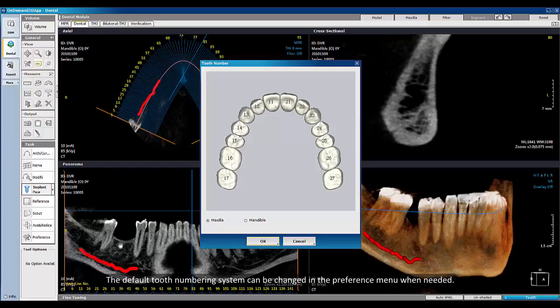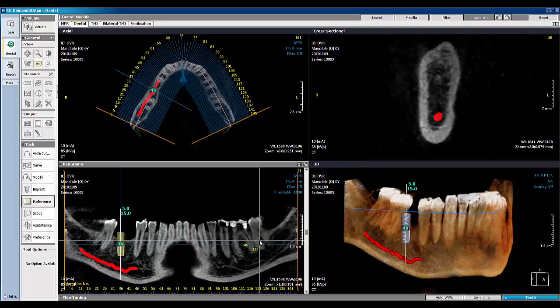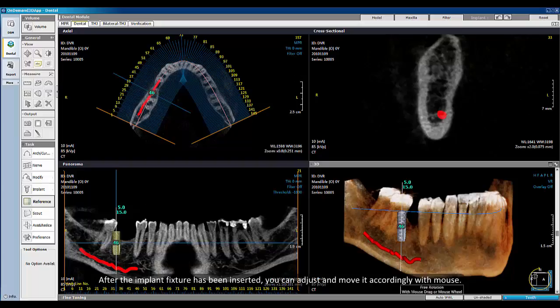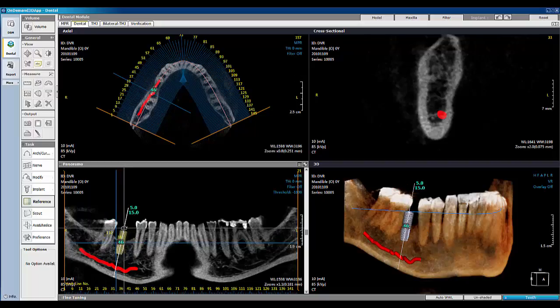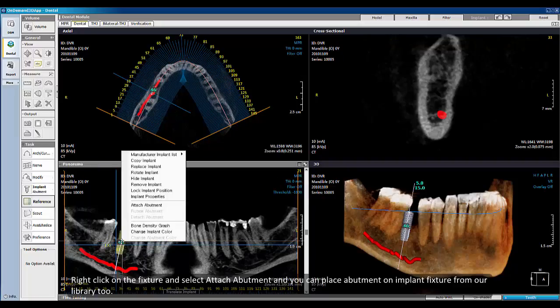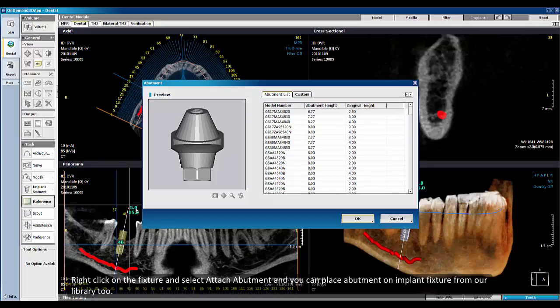The default tooth numbering system can be changed in the Preference menu when needed. After the implant fixture has been inserted, you can adjust and move it accordingly with the mouse. Right-click on the fixture and select Attach Abutment, and you can place an abutment on the implant fixture from the library as well.